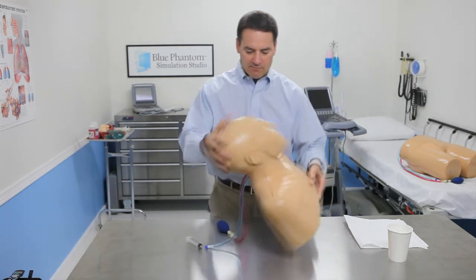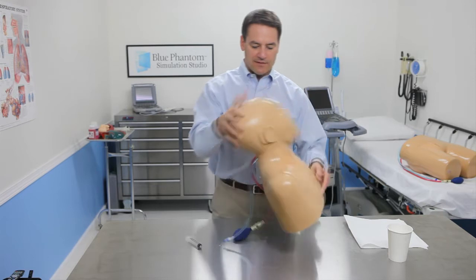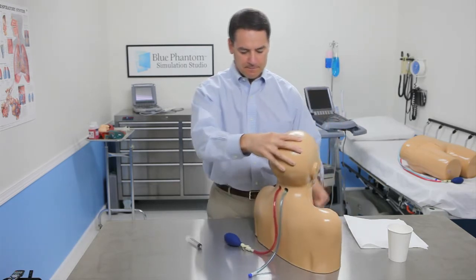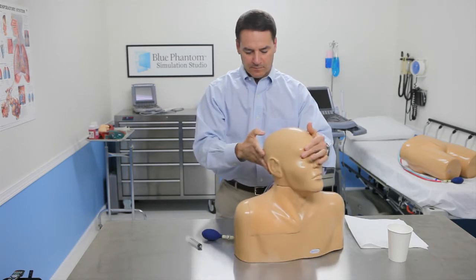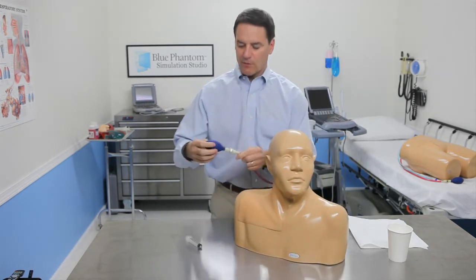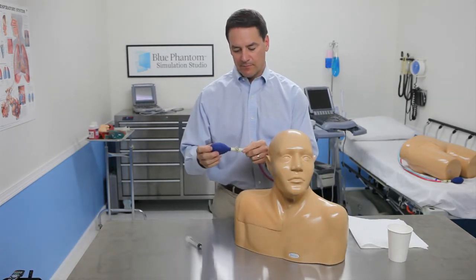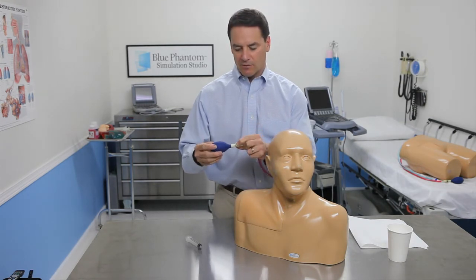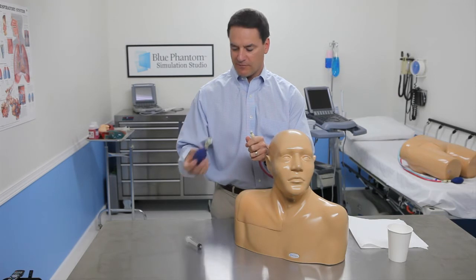Once I put that in, I'm going to roll it around so that the soap can coat those tubing, and I'm going to remove the hand bulb. I do this by depressing this little metal clasp, which will easily pop off of the model.